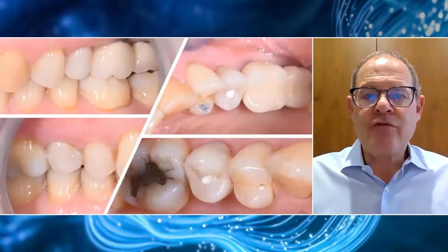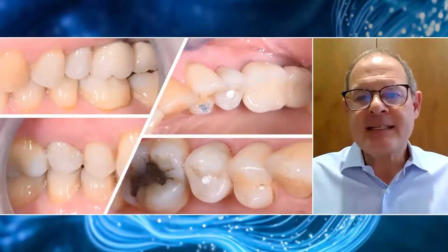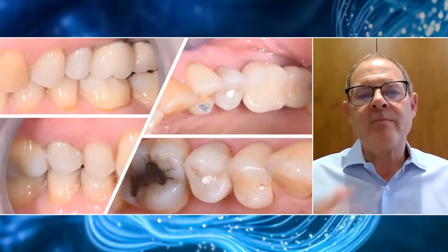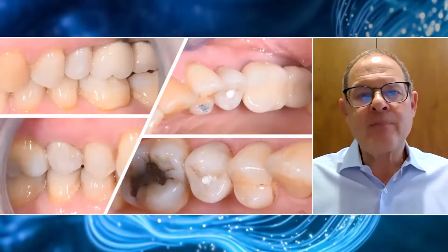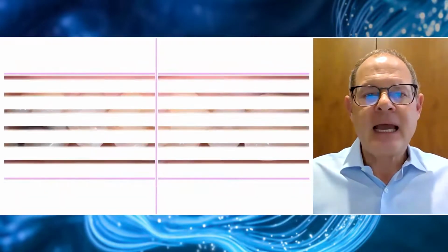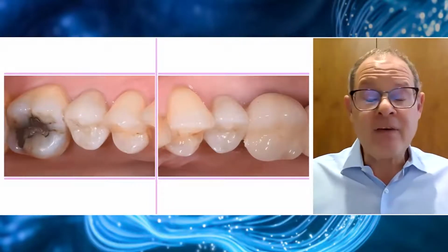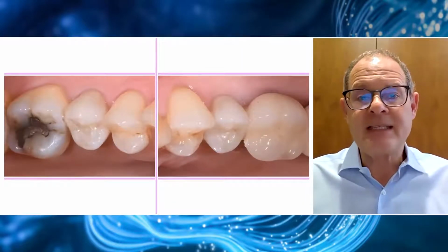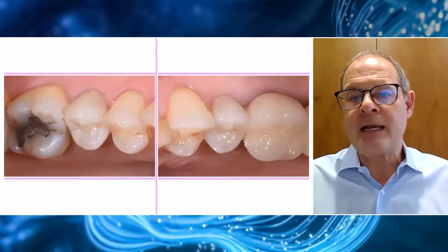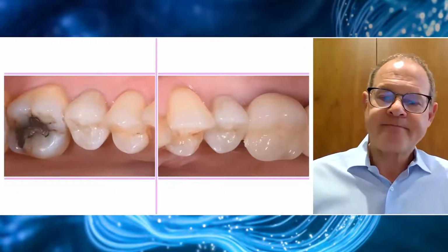So here we see the two crowns secured intra-orally. And initially we place a temporary wadding and we wait for 3 months, at which point we bring the patient back, check that the preload has not been lost before we finally place our permanent composite filling. I have to say I'm in the middle of another 2-year study with custom base abutments, and it is extremely rare to find that there is any loss of preload. These restorations are mechanically very stable.